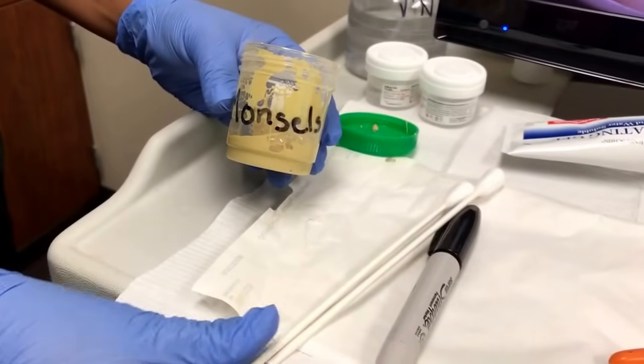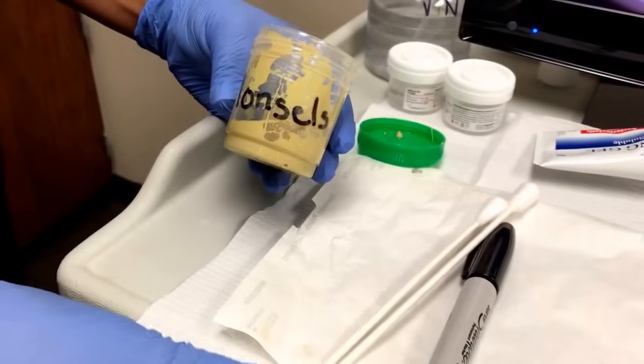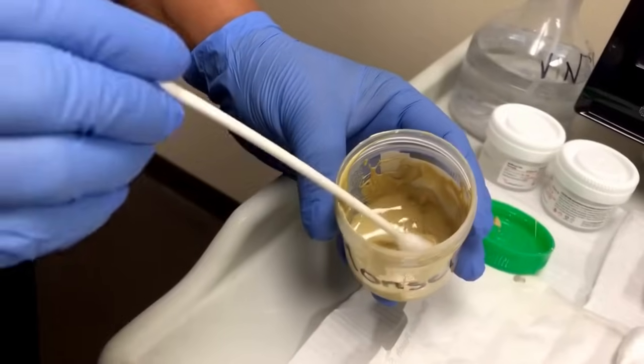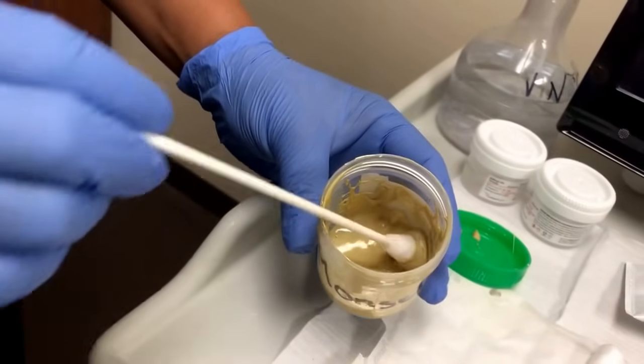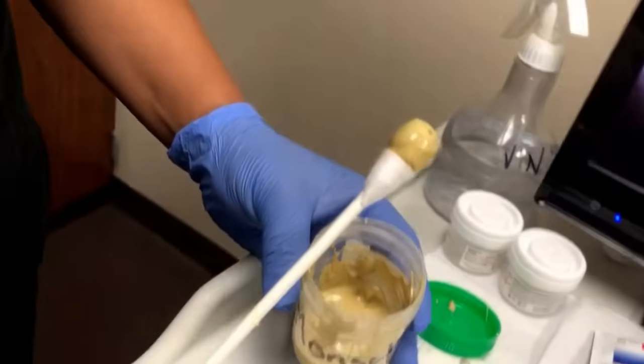After the biopsies have been collected, the provider will request Monsell's. That is when you take the OB-GYN swabs, place them into the Monsell's, swirl it, and this amount of Monsell's would be sufficient.